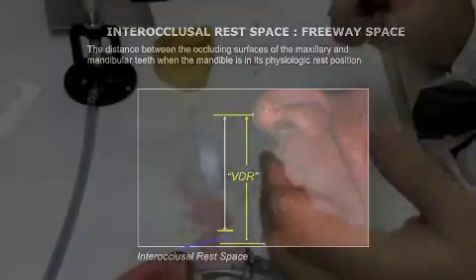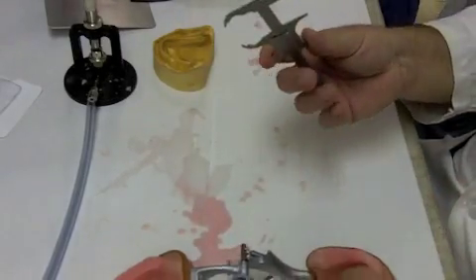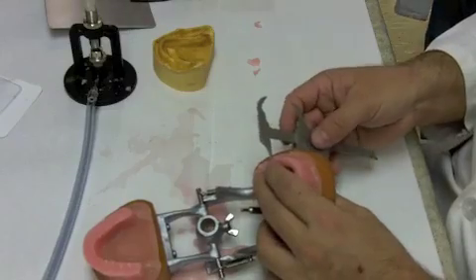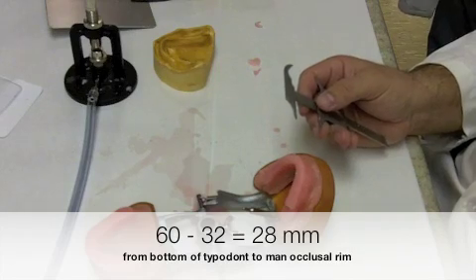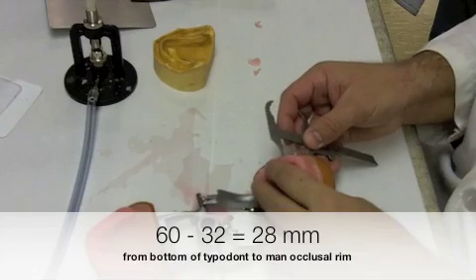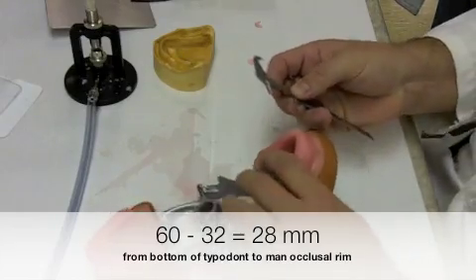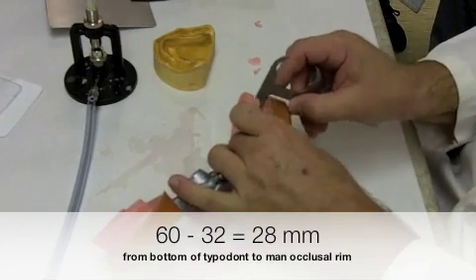Or, for our typodont, since we want a total of 60 millimeters, and we've already set our maxillary rim at 32 millimeters, we can just go up 28 millimeters from the bottom of the typodont. That plus the 32 that we did from the top of the typodont to the maxillary rim will give us our 60 millimeters.